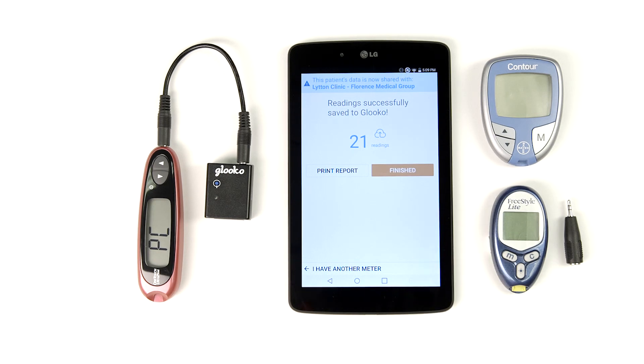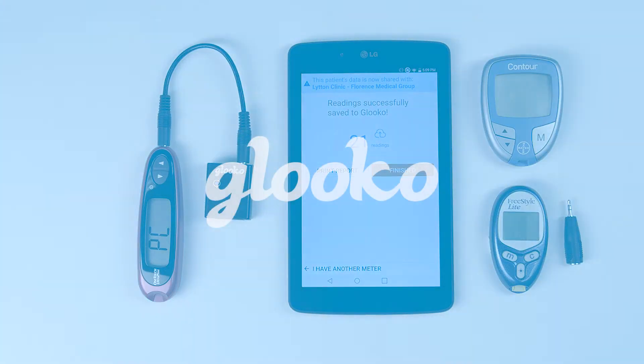You've learned how to sync most of our supported meters with Glooko Kiosk and attach your patient's data to their Glooko profile. Happy syncing!